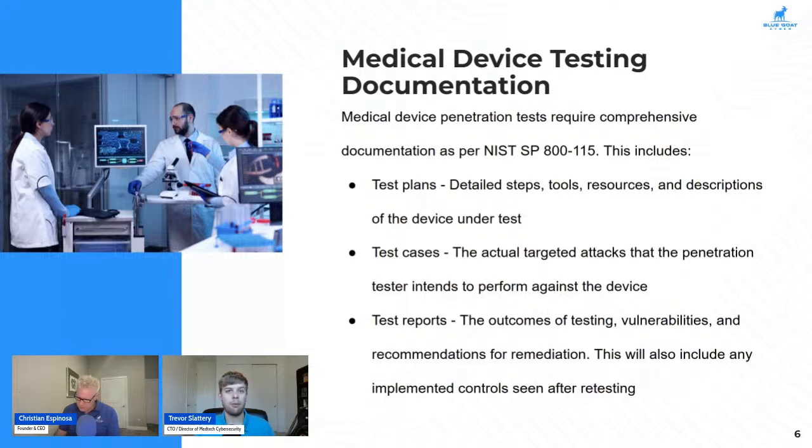This is a very important distinction to have, as it is required that penetration testing is done by an independent third party. It cannot be done internally. So we're talking about everyone that's going to be involved in the penetration test, every tool, every system, as well as what we're testing. This is one of the resources that we have. The device itself and any accessories or credentials that we are provisioned are part of our resources. So this is mapping out everything before we go in and actually do it.